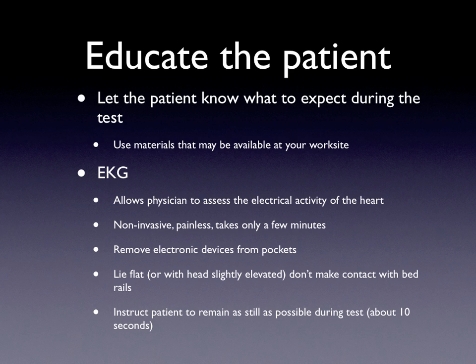Here's how you can explain an EKG to a patient. It allows the physician to assess the electrical activity of the heart. It's non-invasive, painless, and takes only a few minutes. You do want the patient to go ahead and remove electronic devices from their pockets.